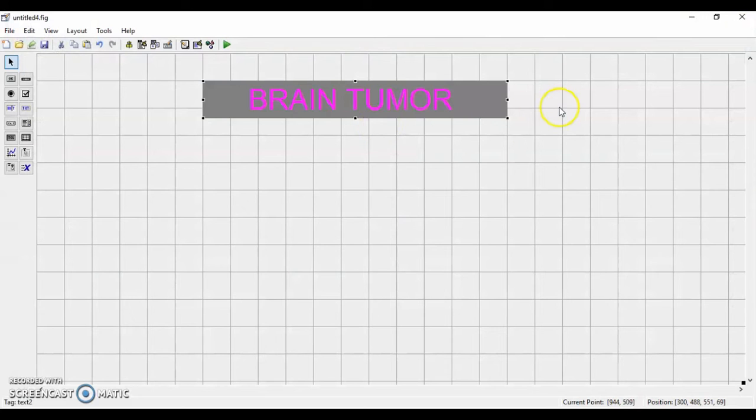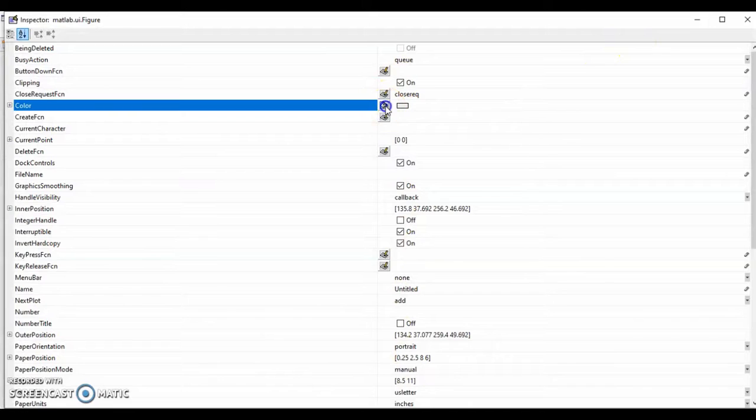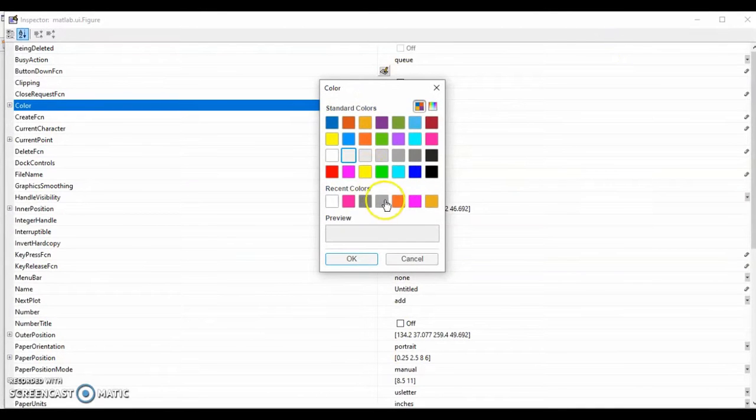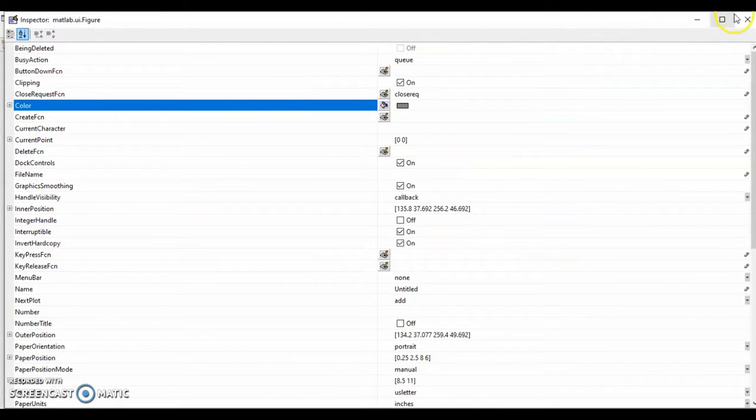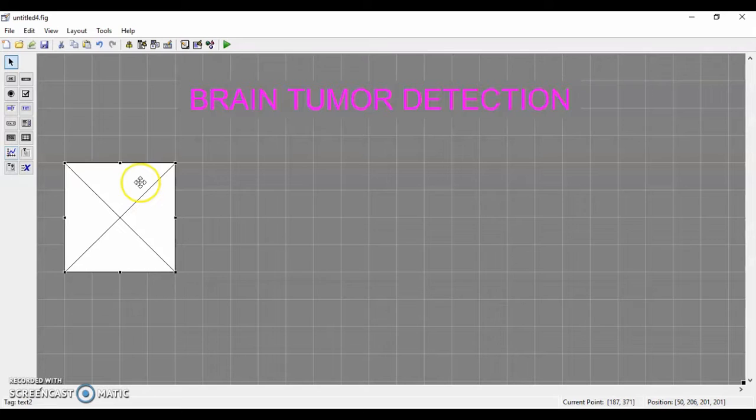So next we will change the background color. So we will change the background color to gray color. Adjust the title to the center. So now we will insert graph axis where our images will be shown later.